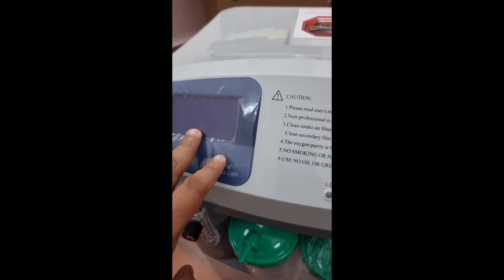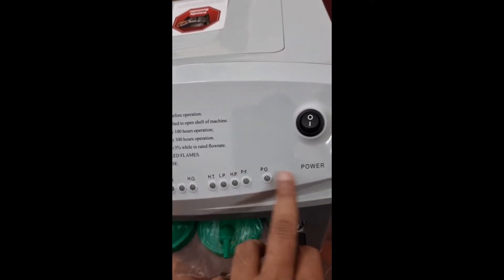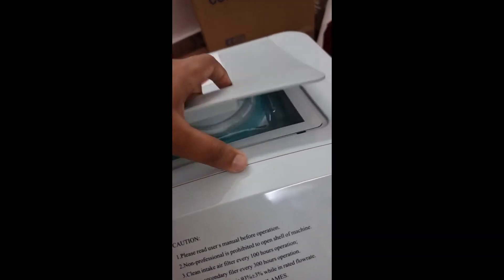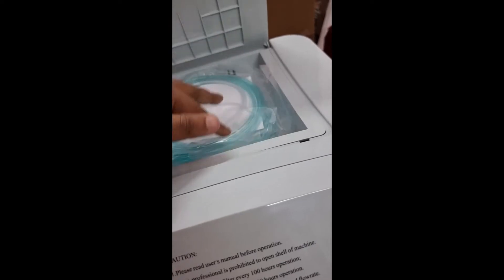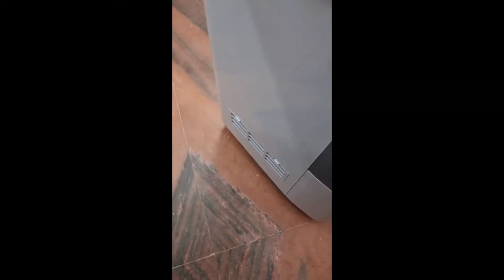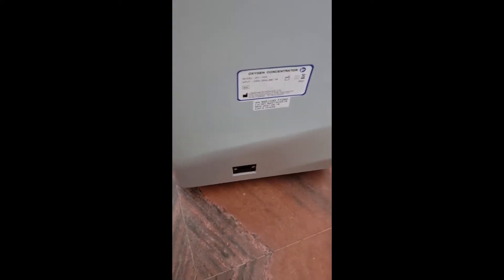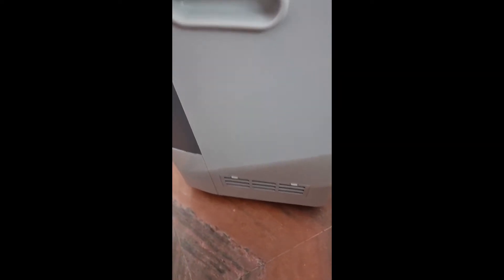There is a display — once we switch on, I will show you what it indicates. There are also some diagnostic alarms, and this model comes with a cabinet. Two cannulas are included. There is one filter at the bottom, which we will cover during the maintenance part. This is where you connect the power adapter, and there is another filter on the side.